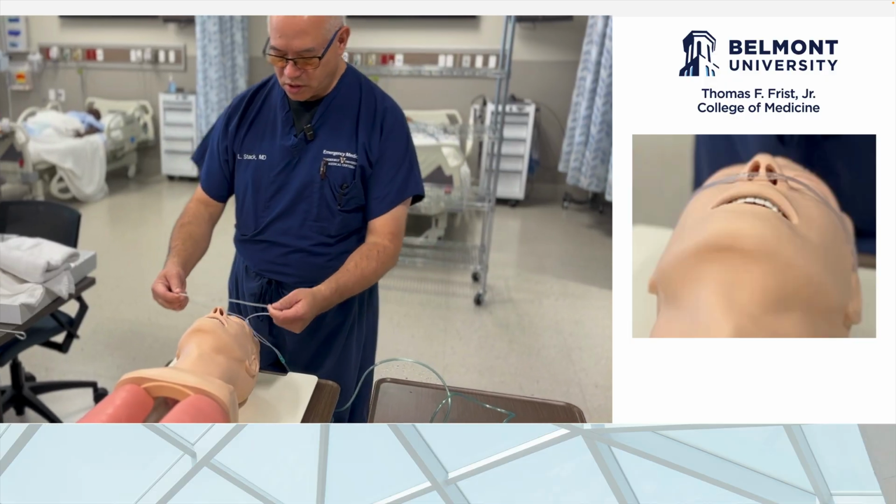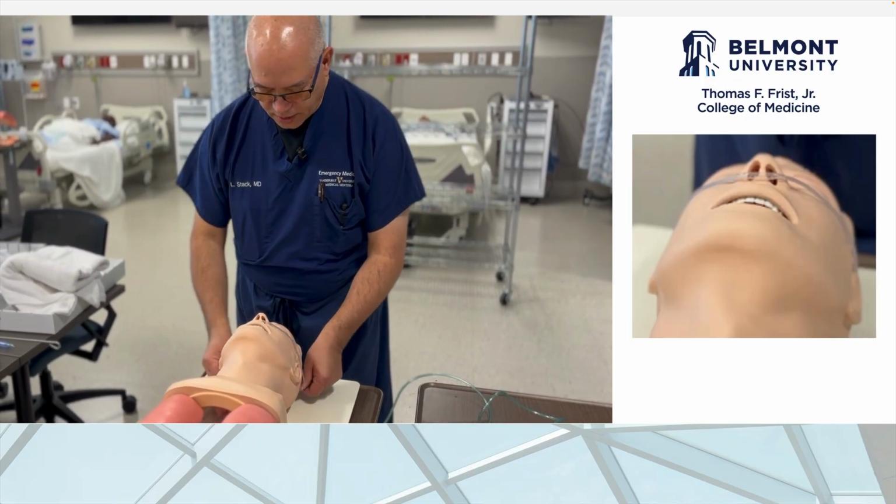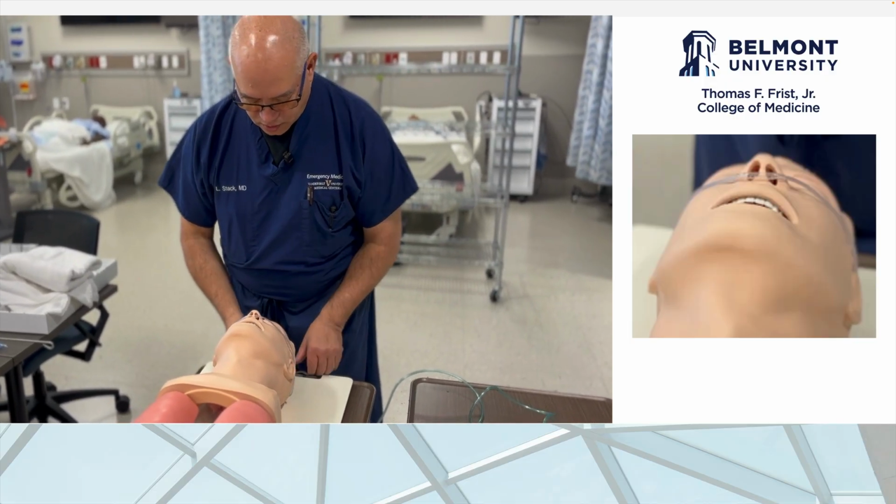In preparation for intubation, first place oxygen on the patient by nasal cannula at 15 liters per minute. This technique extends the safe apnea time during intubation due to the higher concentration of oxygen in the natural reservoir of the pharynx and trachea, which diffuses into the alveoli. This method of oxygenation will continue until the patient is intubated.